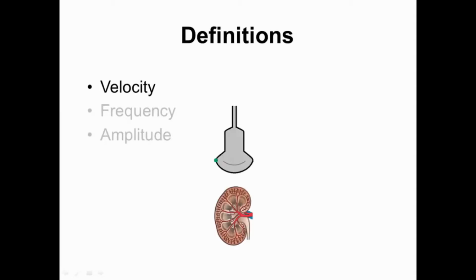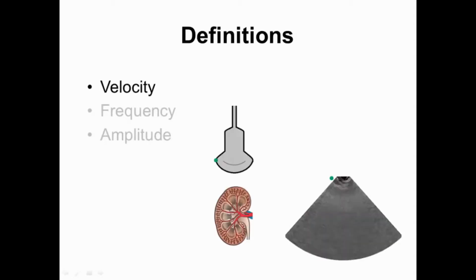For example, let's say we're going to ultrasound this kidney. This is what our screen might look like before any waves hit the tissue. To help orientation with the image on screen, you can imagine the probe sitting on top of the screen pointing downward into the tissues, as this is how they will be relayed. The first waves to return to the probe will be those reflected off the top of the kidney, as they have the shortest distance to travel, and we assume all waves have the same speed. The faster the waves return, the closer the ultrasound machine interprets the reflecting tissues to be.